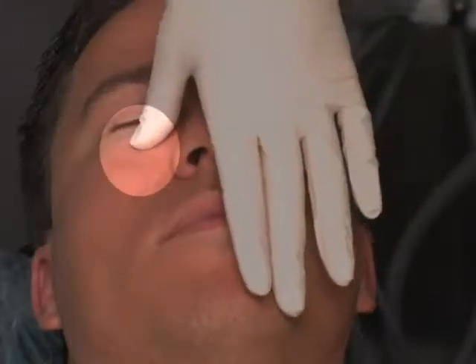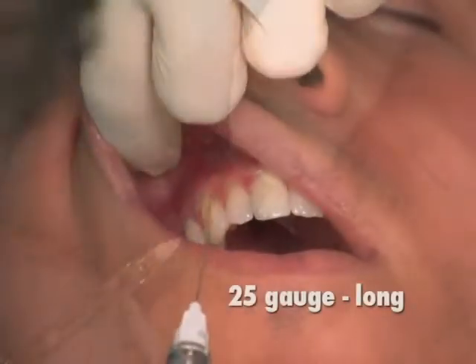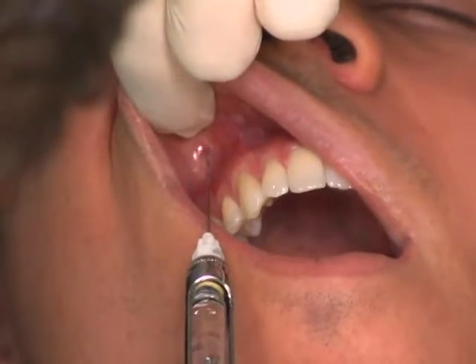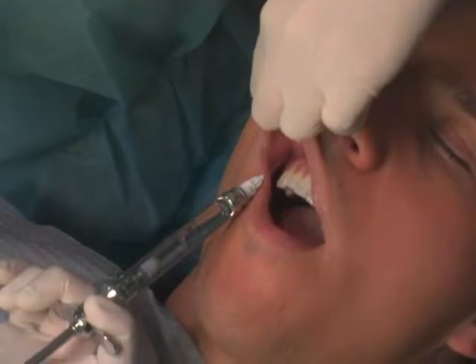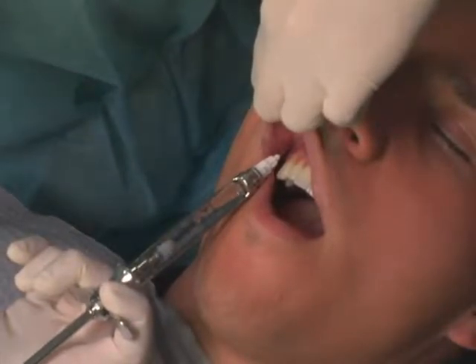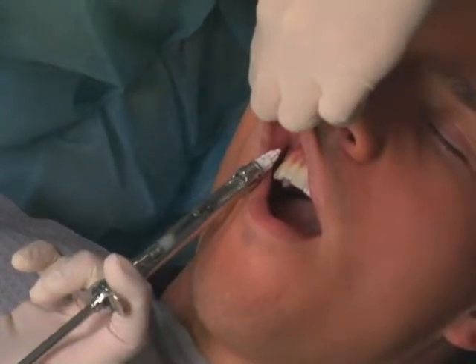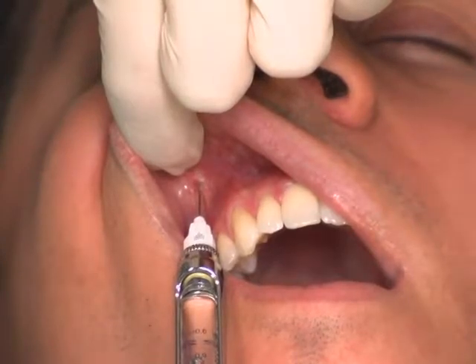The infraorbital foramen is palpated and the lip is retracted. A 25 gauge long needle is inserted into the height of the buccal fold adjacent to the maxillary first premolar. The needle is held parallel to the maxillary bone and inserted until bone is contacted at the roof of the infraorbital foramen. After 2 negative aspirations, 1/2 to 2/3 of a cartridge of local anesthetic is deposited over 30 to 40 seconds.